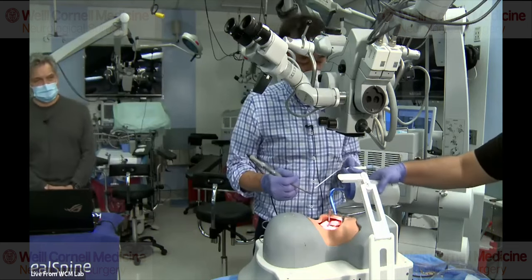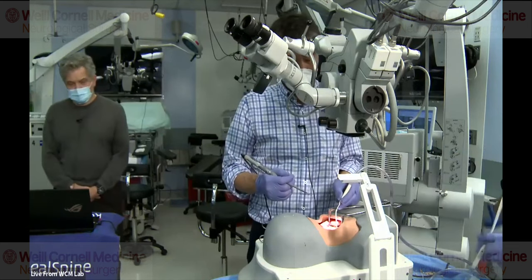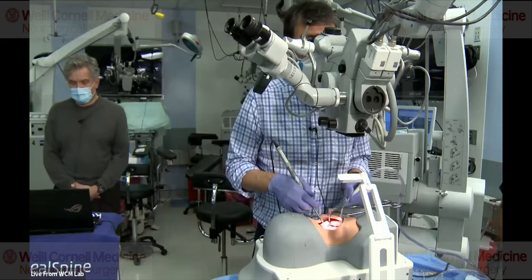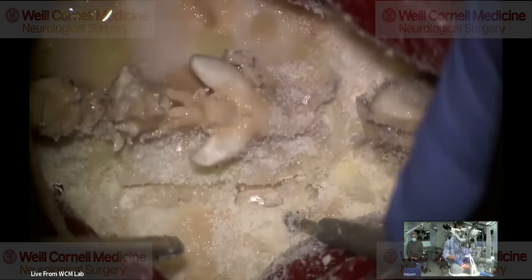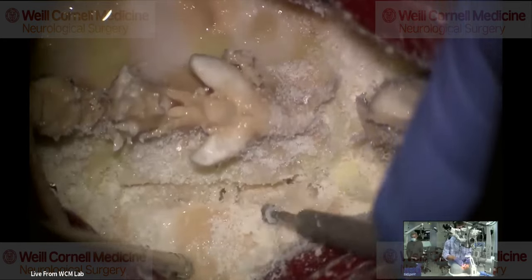So whatever you like and feel most comfortable with, I think, is a reasonable thing. I'm going to demonstrate with a NuVasive today. So I'm done on this side, and you want to make sure that the cuts are straight.